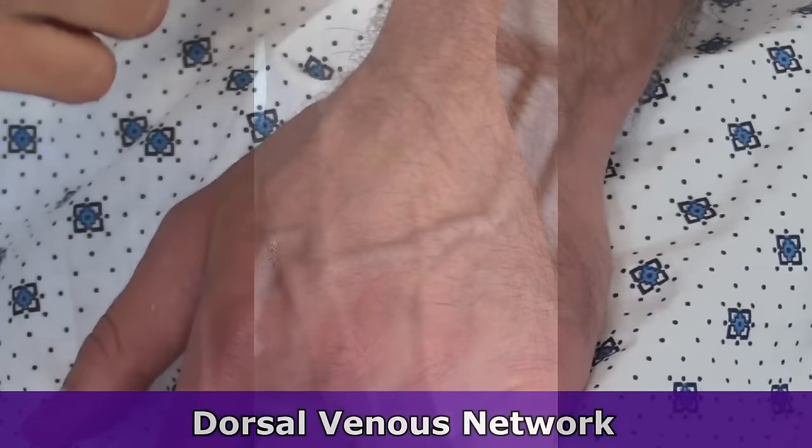With these patients, you're really going to be going by palpation of that vein rather than actually seeing it. On patients who are healthy and do a lot of cardiovascular exercise, those veins are nice and superficial at the surface, and once you apply that tourniquet, they just pop up. But on patients who have bad veins, that doesn't happen. You'll put the tourniquet on and those veins really just don't pop up as great as someone who has those nice engorged veins.